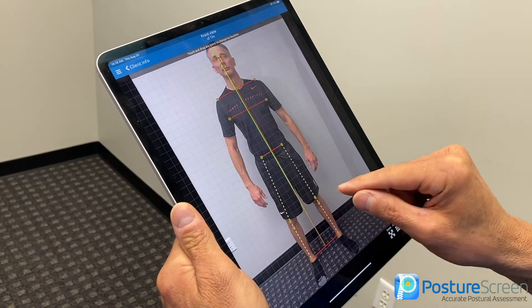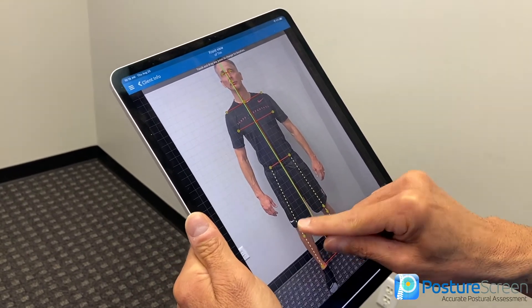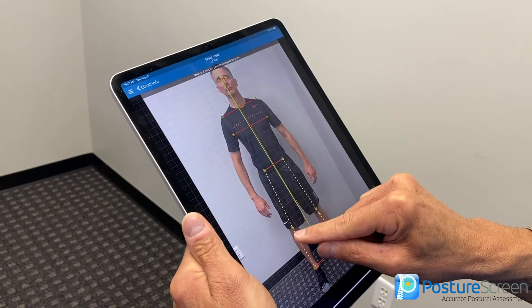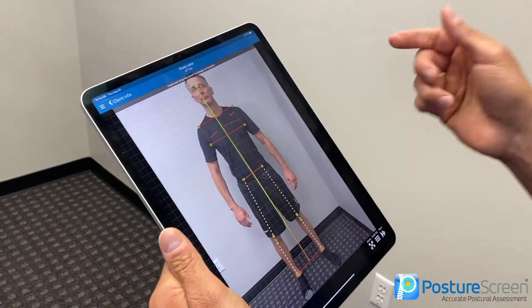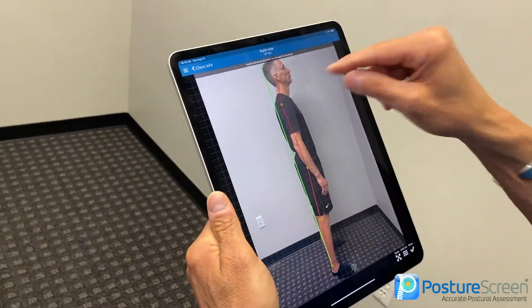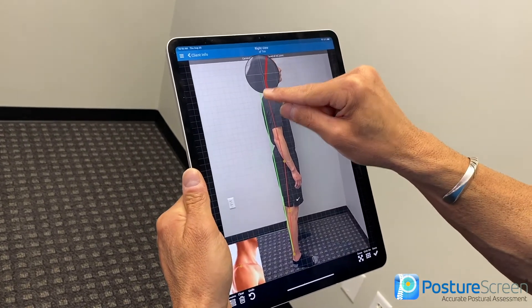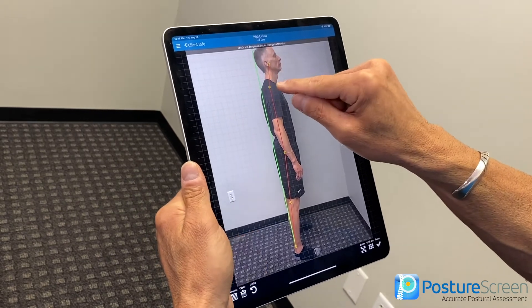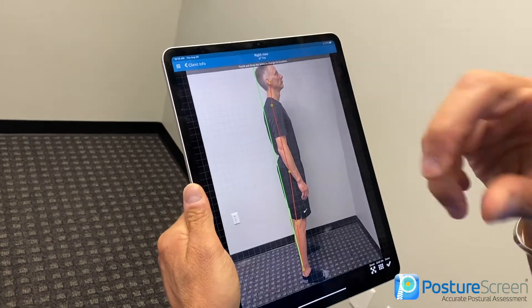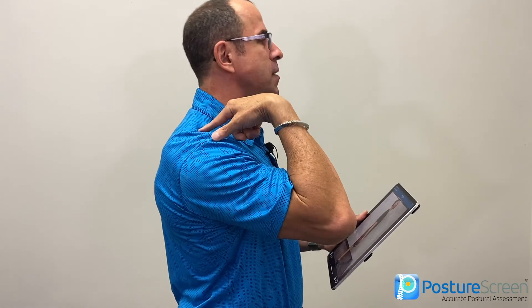The reason it got confused on the knees is simply because of the shorts — it's trying to estimate based on the shorts. You might want to consider having tighter fitting shorts. Always double check this point too; make sure it's on the external auditory meatus. The base center of the neck is where you should place the point, even if they have shoulder protraction. If they have shoulder protraction forward, the dot needs to be at the base center of their neck at the height of the shoulder or the AC joint — because if you just put it on the AC joint with shoulder protraction, the head might look like it's backwards.